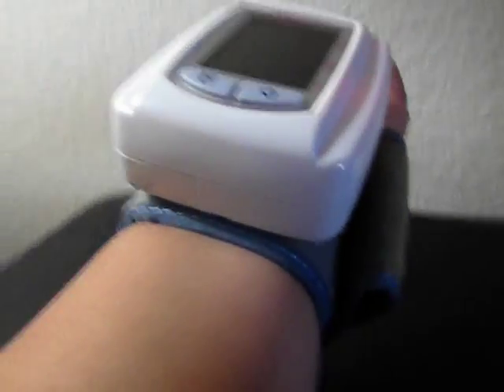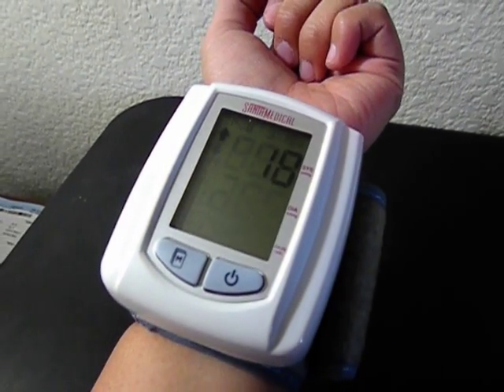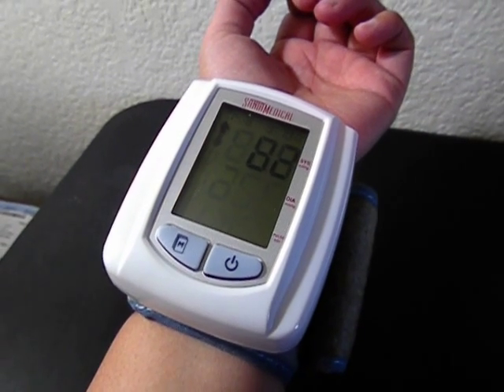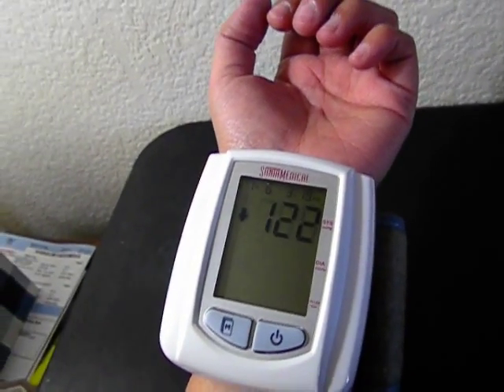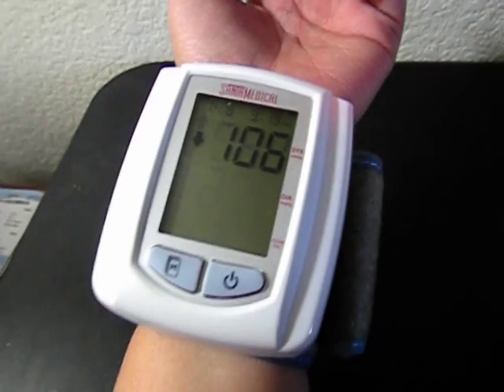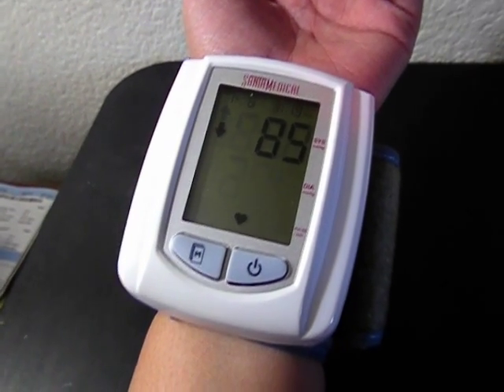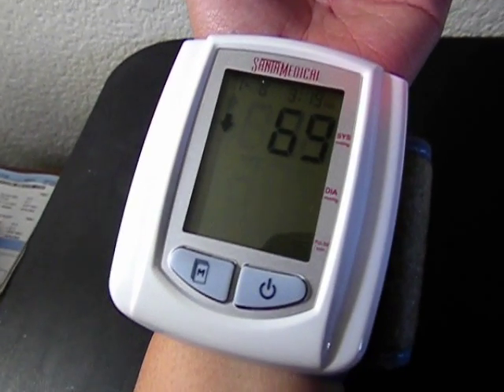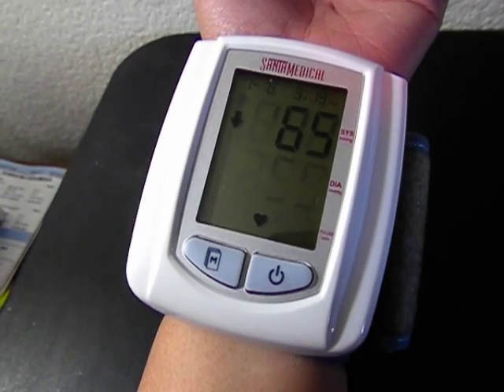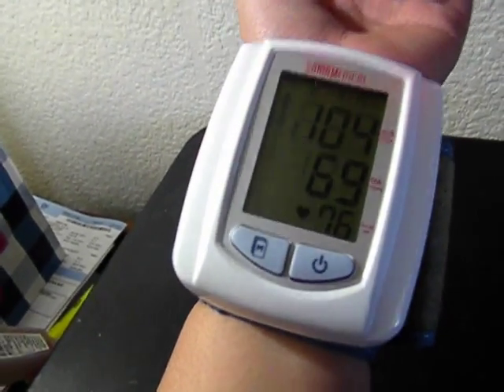So I'll push the power button. Let's open it up. I'll push the power button. So my blood pressure is 104 over 69 and my heart rate is 76 beats per minute.